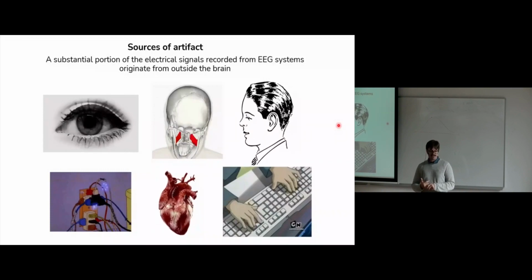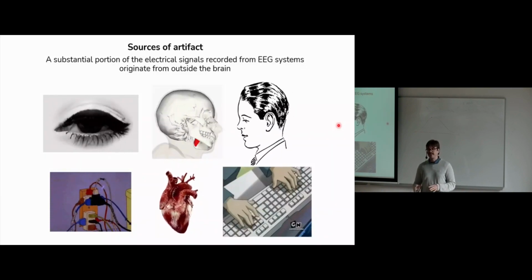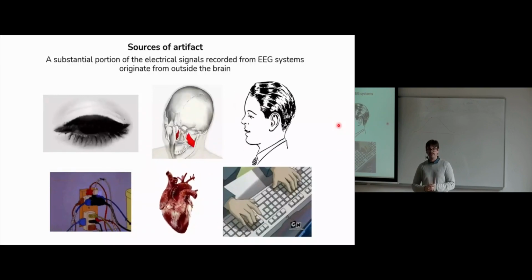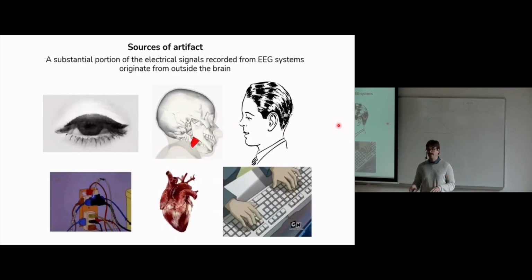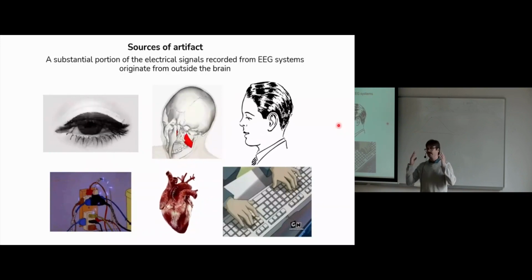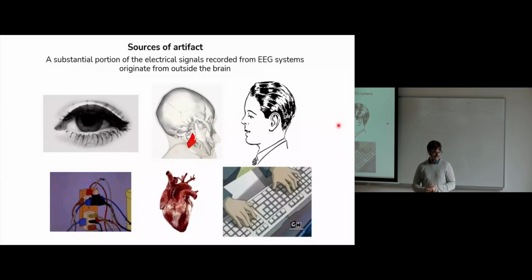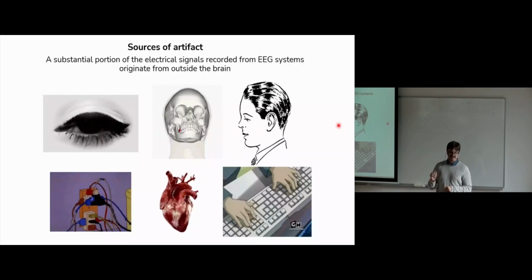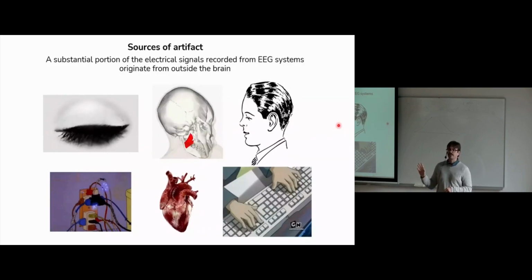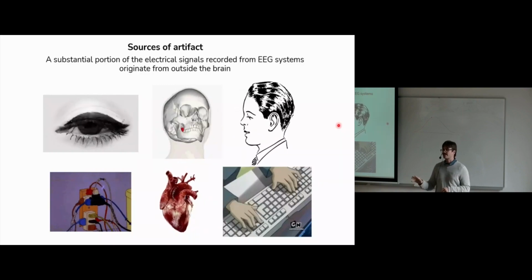Even though I have typing listed here, it could actually be tonic EMG that's affecting the EEG. There might be no actual movements; you're just activating the muscles in your body, and that's shot through the skin to the skin of the scalp. I didn't put a citation here, but for those of you that don't know the study of Fitzgibbon et al. and John Willoughby, who are in Adelaide, Australia, they literally paralyzed participants.